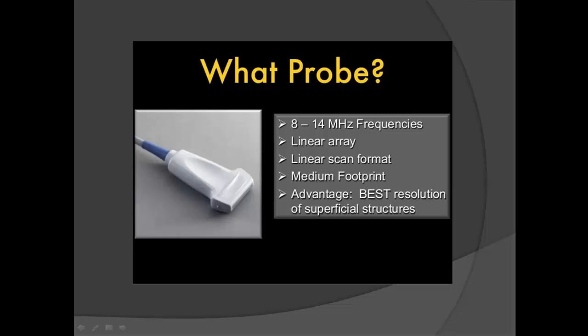So first things first, with this history, you're concerned about, obviously, an ocular pathology. You're wondering about a differential diagnosis that could include retinal detachment, vitreous detachment, vitreous hemorrhage. She doesn't report any vision loss, so you're less worried about maybe a retinal artery occlusion, but you're probably going to call ophtho. But while waiting for them to come down, you can do some things in the meantime, and ultrasound is a great way to really evaluate the eye to see what may be going on.